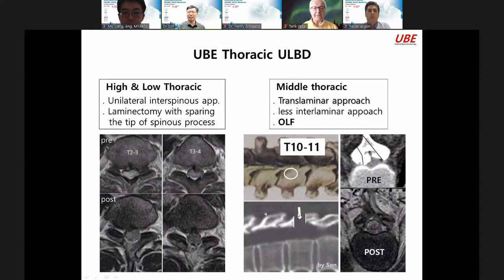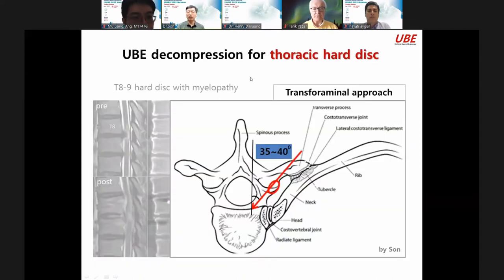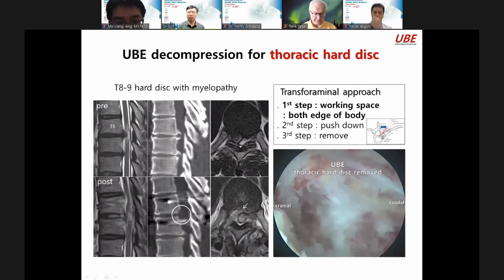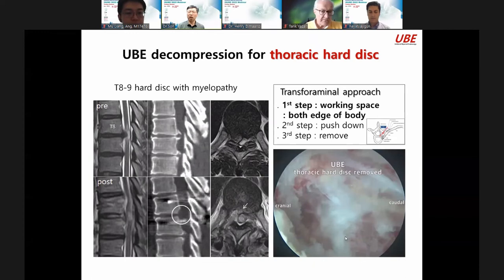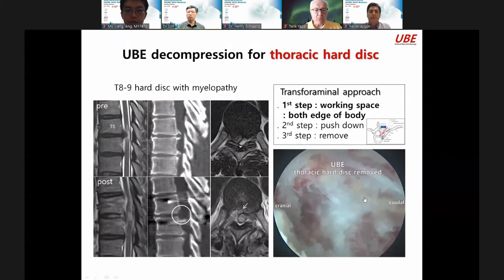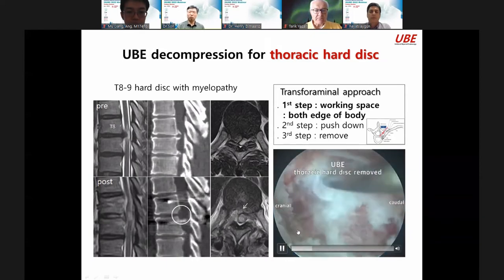Keyhole surgery with less interlaminar approach. For thoracic hard disk decompression with UBE — a very challenging case — I always go through the transforaminal approach. The angle is important. At the thoracic level, creating working space is important. After removing both edges of the vertebral body, you have working space. You can check the dura, then push down the disc and bone spur, and finally remove it. This is my thoracic hard disk surgery.